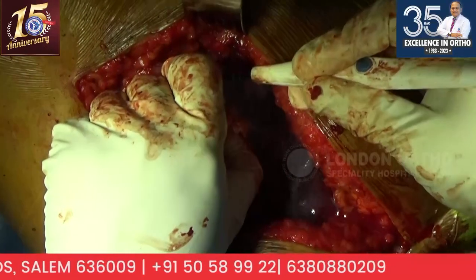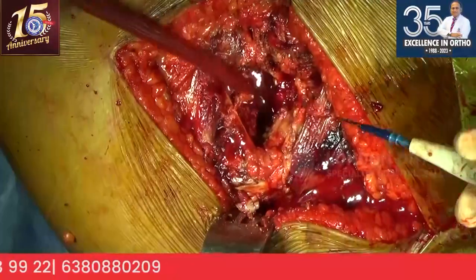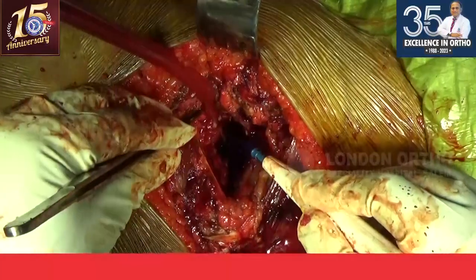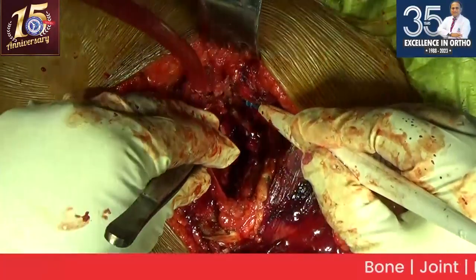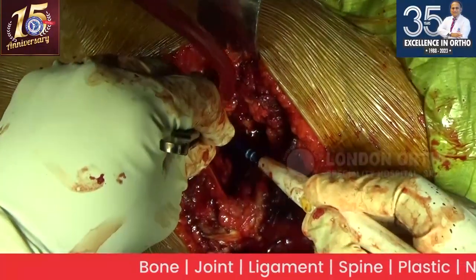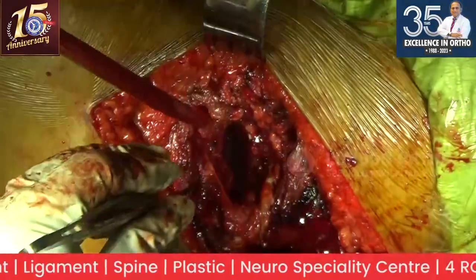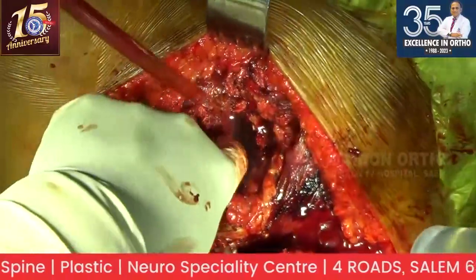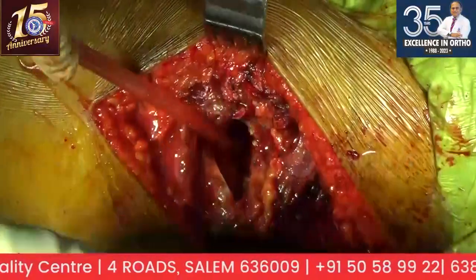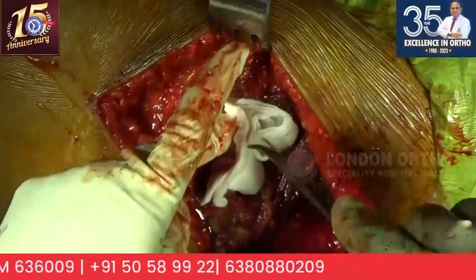Another common mistake that most people make is they use only one stem. For example, they use the Corail 135 for all patients. Suppose a patient has a 127 degree angle and they use a 135, you may get the leg length right, but that's not the entire biomechanics. We now know that the neck shaft angle is an important parameter which you have to respect. Now that we have stems of 127 and 131, as we keep refining, we have to move towards respecting the neck shaft angle and getting closer to your native neck shaft angle. Very important, I think.